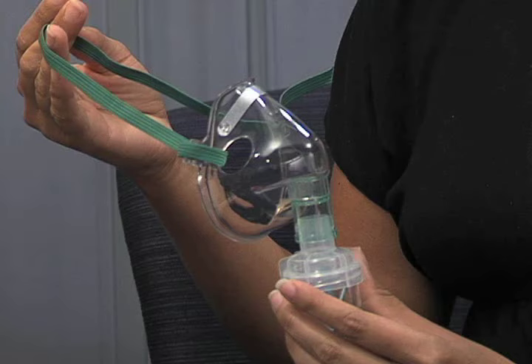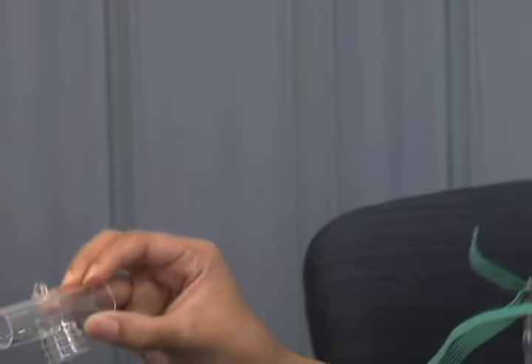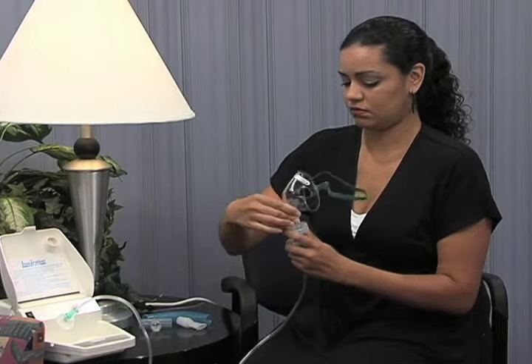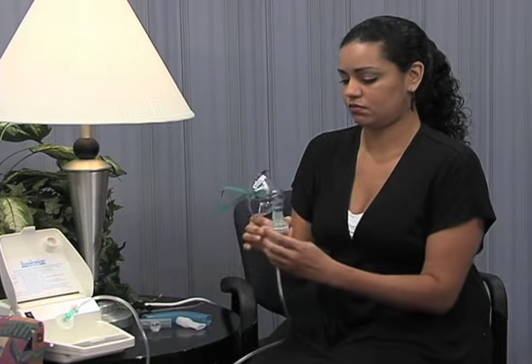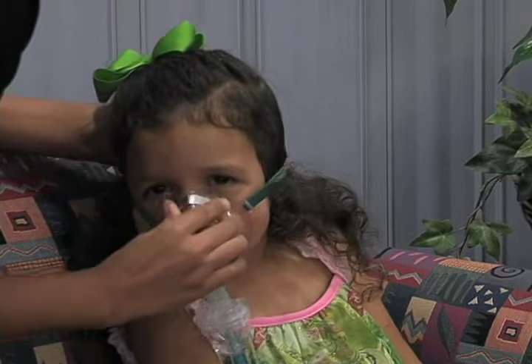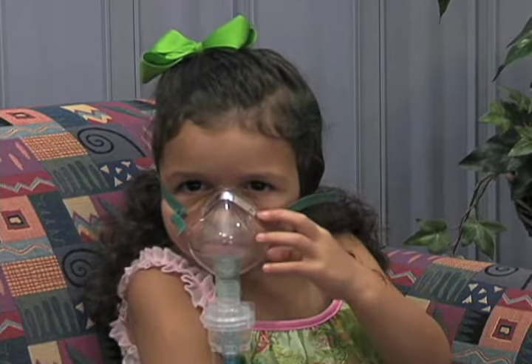Mask treatments are used for children less than 8 years old, or when many treatments are given in a row. With the mask treatment, you will not use the T-piece assembly. The mask is placed directly on the medicine cup and then placed over the child's mouth and nose. The mist fills the mask so the child can breathe it in whenever they take a breath.